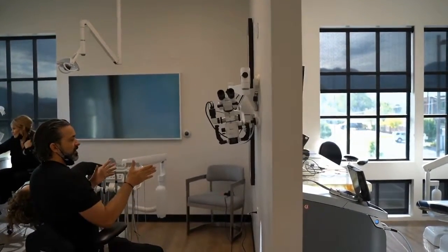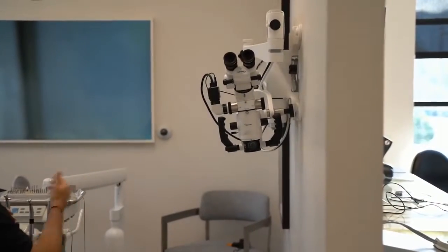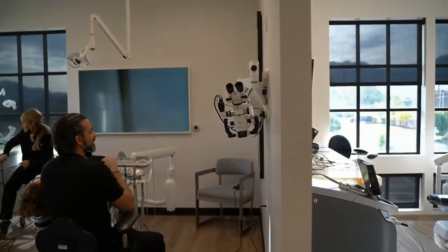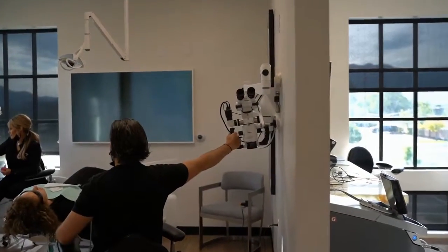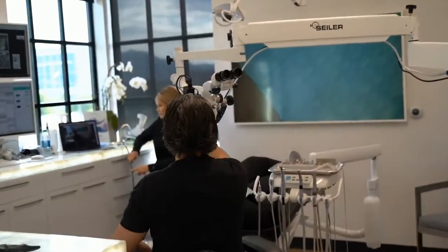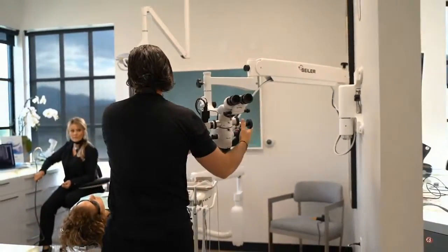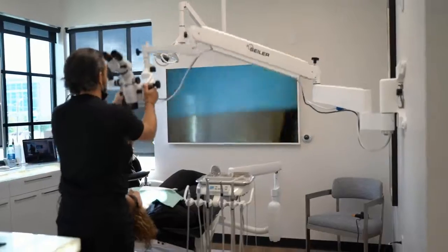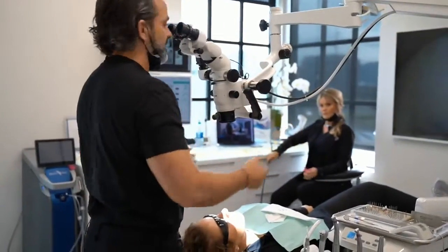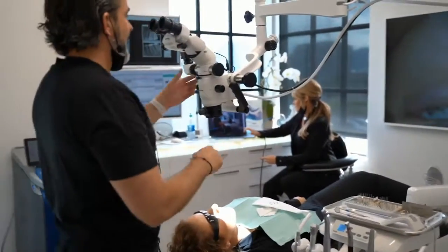So people can walk into that chair. There's a nice natural space here where the patient's chair is, or the companion chair is, and it just tucks in, and then it's very naturally easy for me to reach and bring over to my patient in a seated position. And if I'm doing a quick consult and I want to stand up and bring it over, that boom in that position is very easy for me to use for standing dentistry or standing surgery. So they had me at that point.